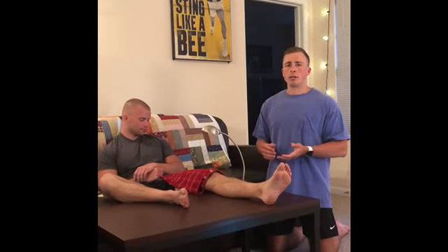We're going to set it to continuous on the machine, and then we're going to ignore the part where it asks about the pulse duration or the pulse period due to the fact that we're using a continuous method. Then we're going to set the time to about 20 minutes, and once we turn on the machine, we will set the intensity up to the point where Logan feels a warming sensation within the leg. And we want to make sure that it's not a burning sensation, just a small warming effect.